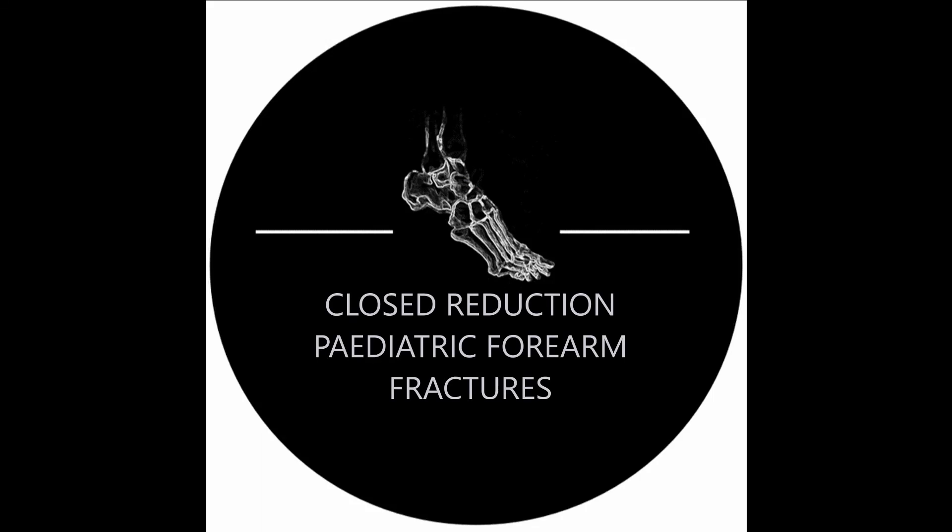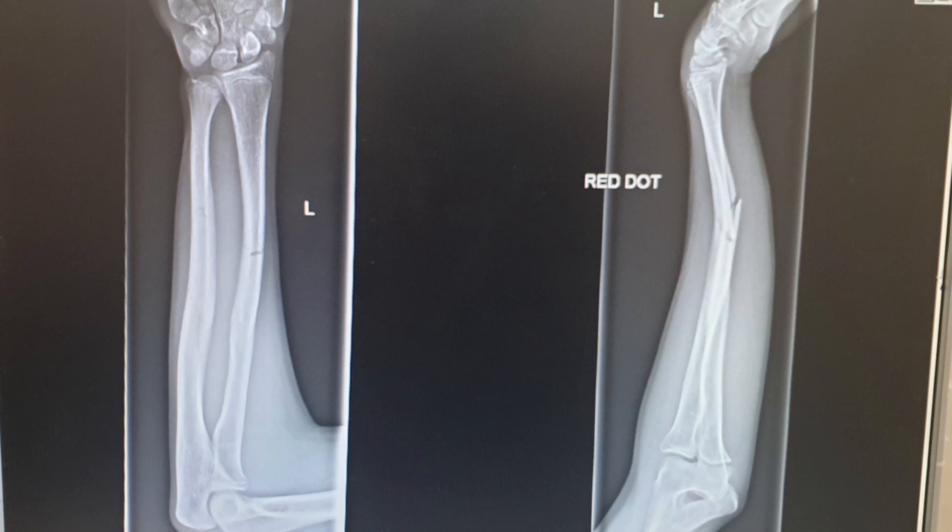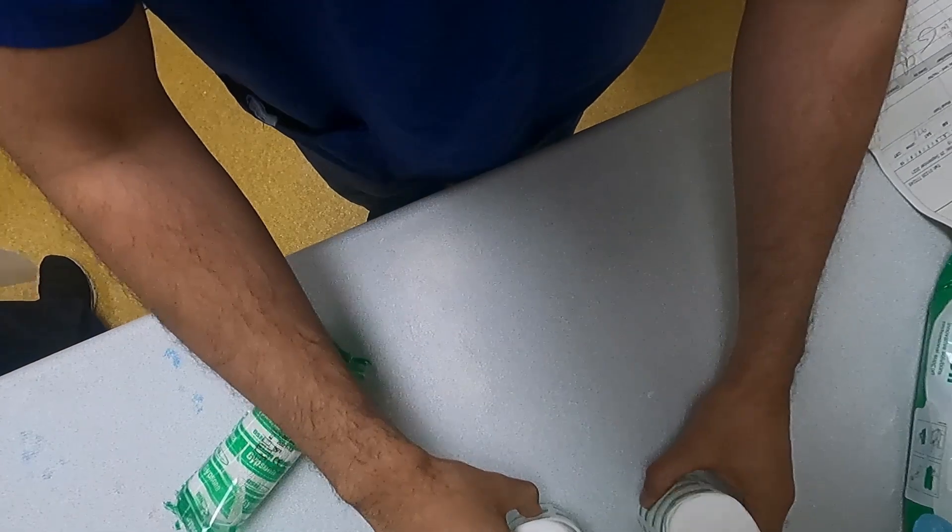How to perform a closed reduction of a paediatric forearm fracture. Plane radiographs demonstrate a greenstick fracture of both the midshaft radius and ulna with a volar apex deformity.